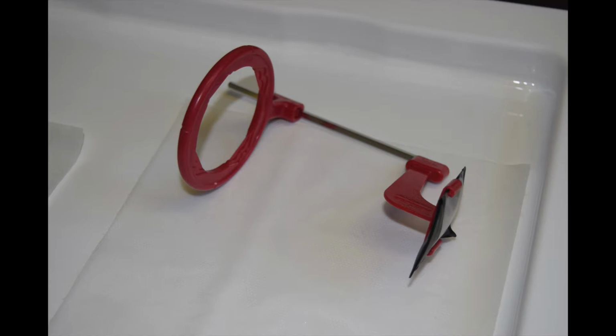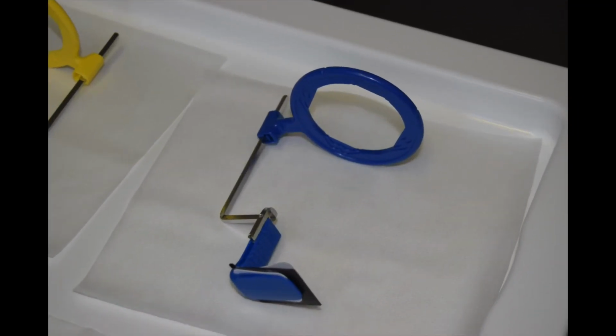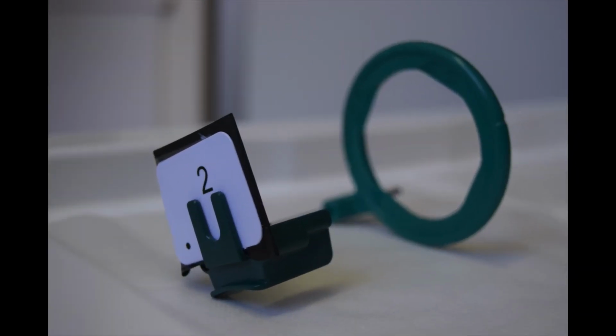Here is a bite wing instrument. Got to be mindful that the holder and the image receptor is actually facing the correct way. As a student, I was always taught if you hold the instrument in front of you and imagine it being a snail, the holder is the body of the snail and then the ring is the shell. This image indicates that the image receptor was correctly placed. And here we have the blue anterior periapical holder, and here we have the yellow posterior periapical holder. Here we have the endodontic green holder.